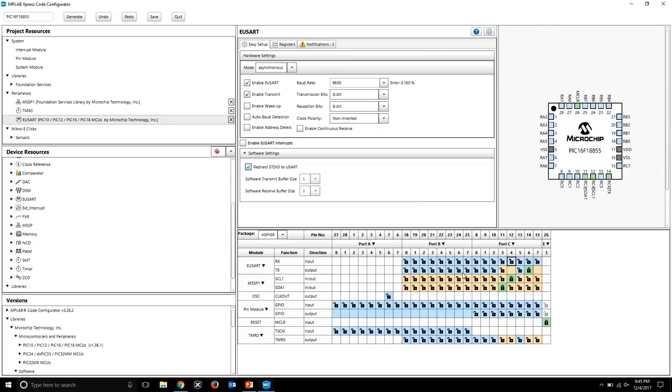Okay. All right, so from here, you can see that TX and RX are actually RC0 and RC1. They're written here for the USB communication. So I'm just going to go in here and select RC0 and RC1. Right there, TX and RX is set up. Perfect.